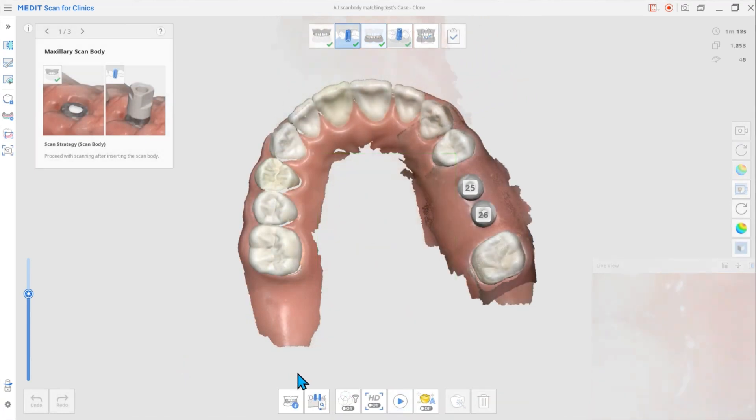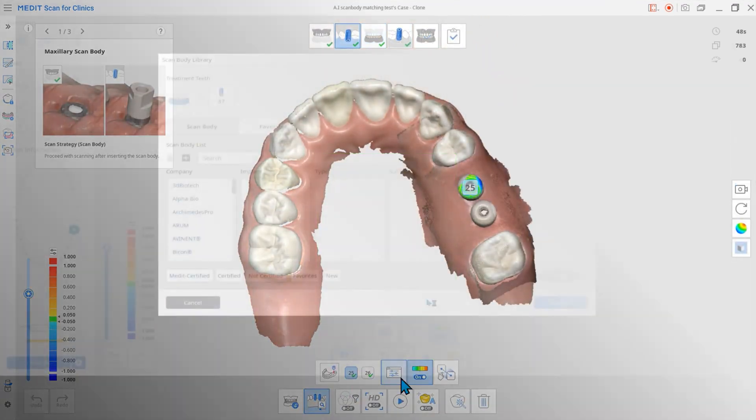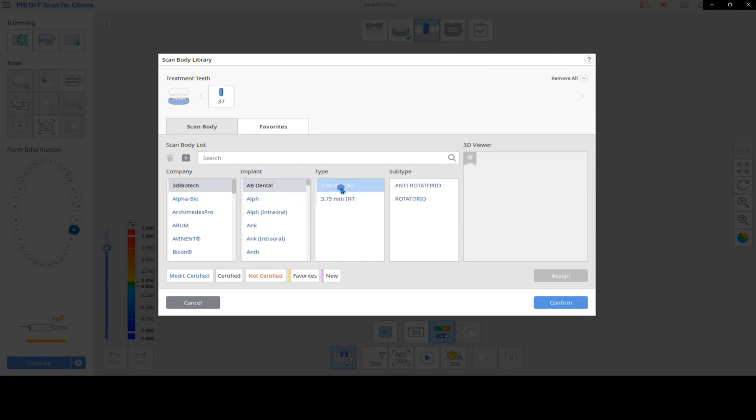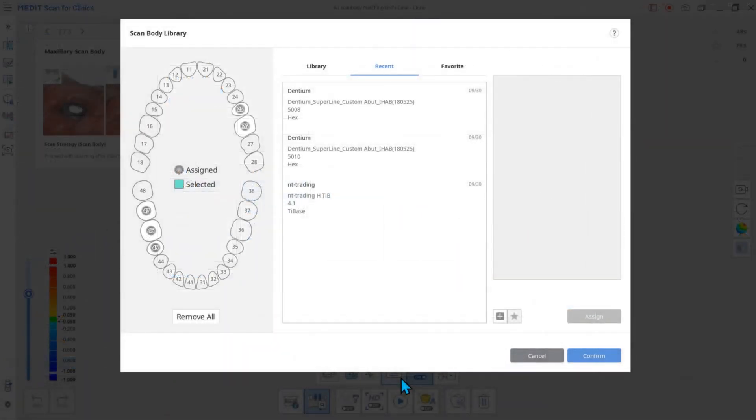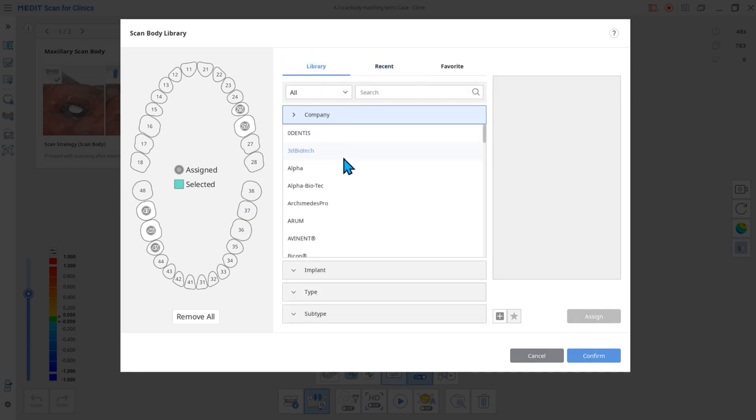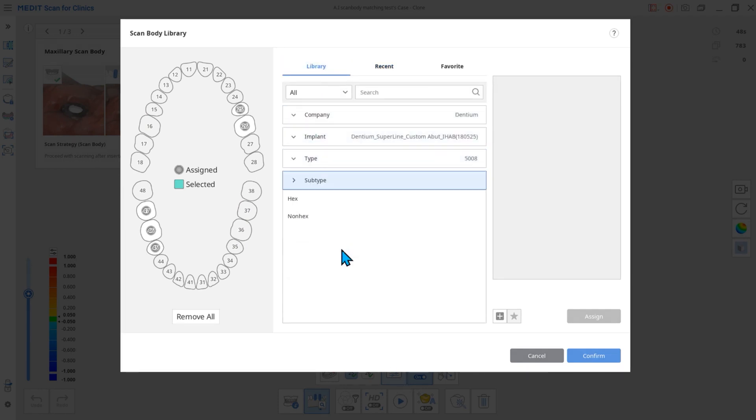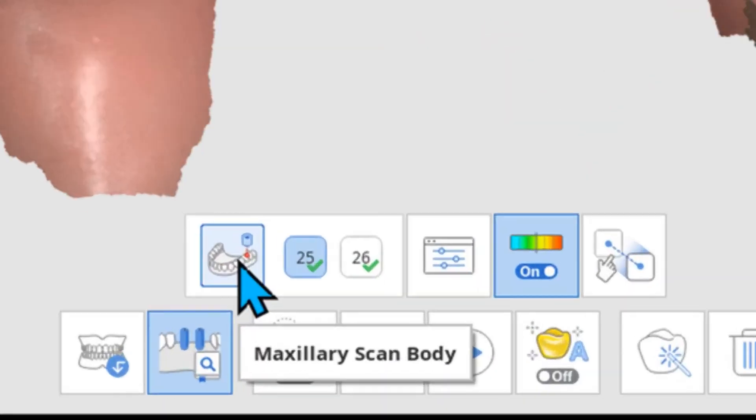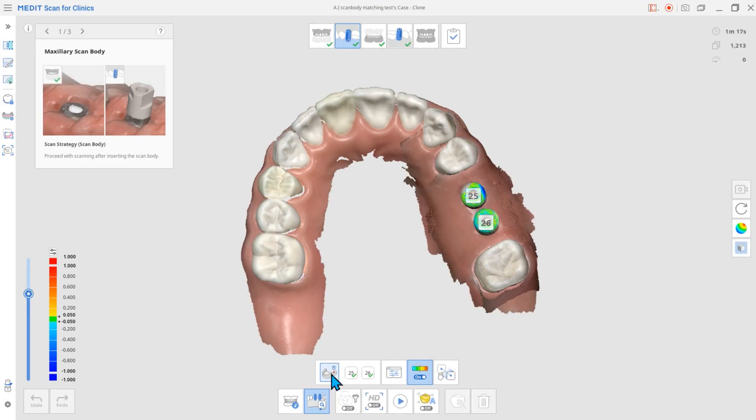Next is the improved AI matching function. We enhanced the AI abutment matching and AI scan body matching features. We improved the dialog window that assigns libraries to tooth numbers to be more intuitive and user-friendly and changed the library to align with the scan body base scan.